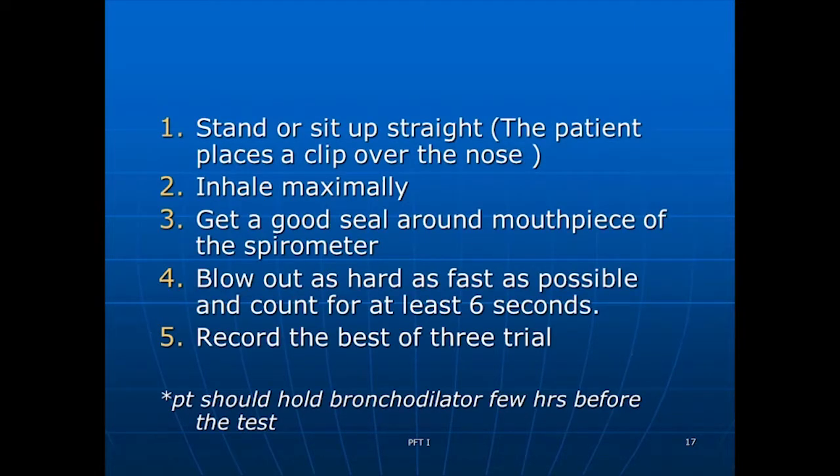So how do we do it? Again, the patient's going to stand, but they usually sit. They sit upright, and the patient places a nose clip over their nose. They will inhale maximally. They get a really good seal around the mouthpiece, and they blow out as hard and as fast as possible for 6 seconds. That's the gold standard, to blow out into the mouthpiece for about 6 seconds. Therapists will usually have them do this about 3 times, and they record the best of 3.